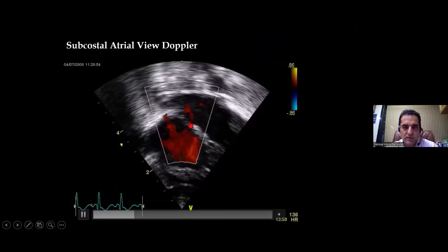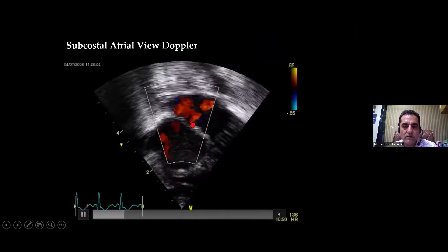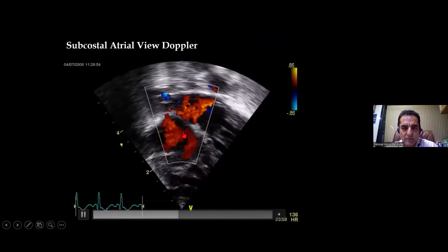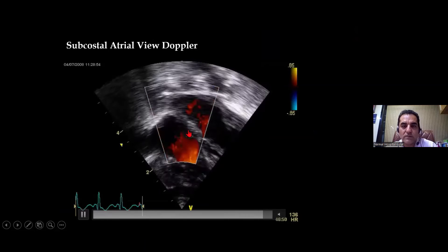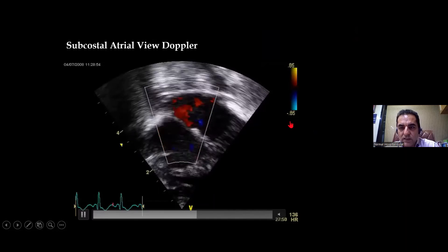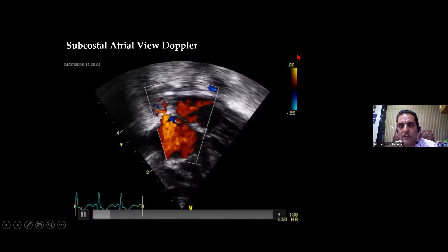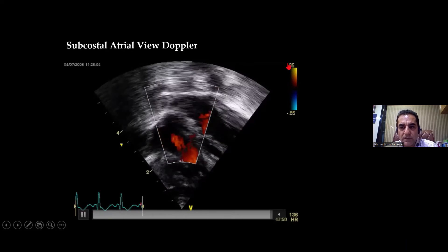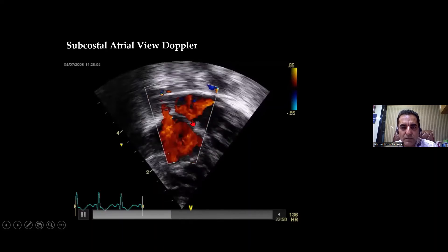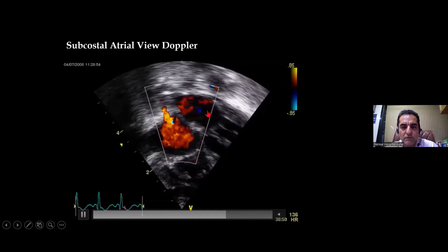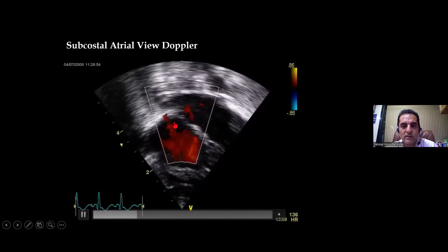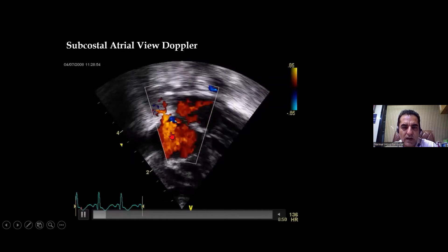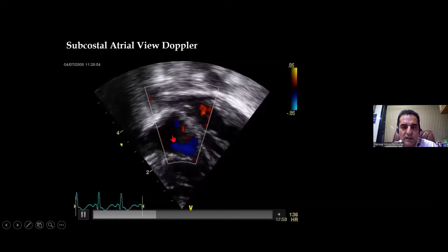I'm doing color Dopplers to look for flow in the intra-atrial septum. You will not see any flow through this intra-atrial septum even though I noticed the PFO flap. Why? Because this range is high — this range is set for an arterial flow system. If I decrease this range, I will start seeing the color flow through the PFO, because this is a low velocity system. And this red jet entering into the RA is your SVC — superior vena cava flow.